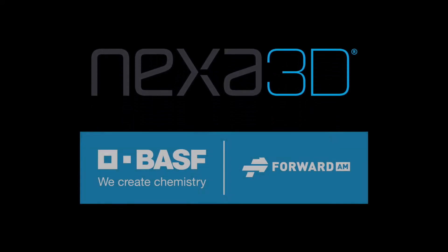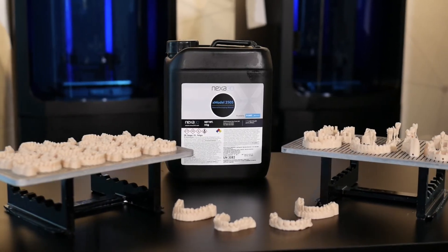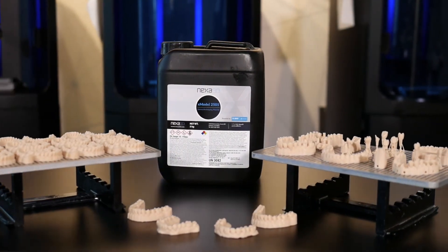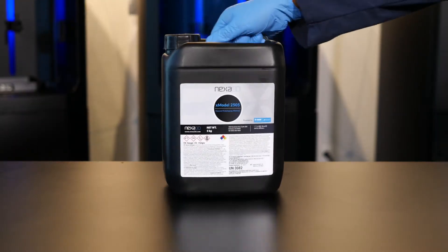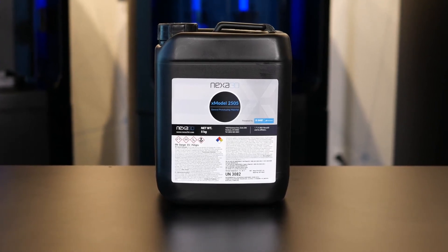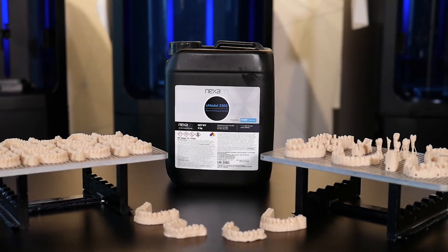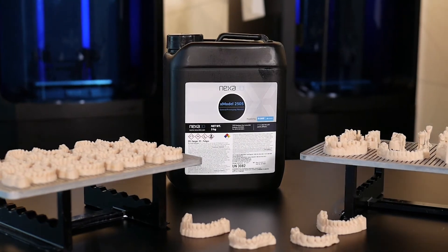Nexa 3D introduces X-Model 2505, a new dental model material powered by BASF Forward AM. This rigid beige colour material is ideal for the ultra-fast production of additively manufactured thermoformed dental models, dental removable dies and other dental model applications. X-Model 2505, printed on Nexa 3D's NX-D200 3D printer, delivers higher print accuracy that brings the total cost per model down for dental prosthetics manufacturers by reducing their printing, post-processing and fitting time.